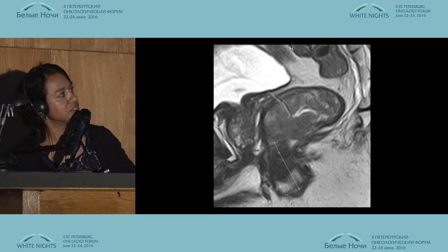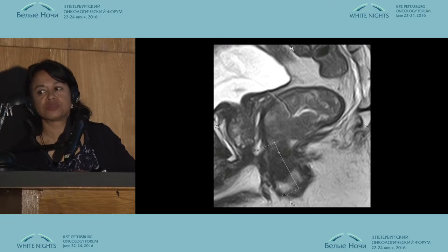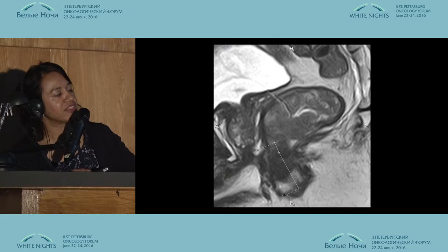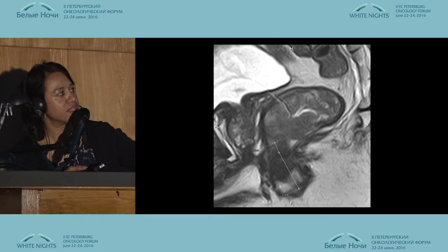These are the measurements we took. We always measure from the lowest point of the internal sphincter, which you see here, and that clinically correlates with the inter-sphincteric groove, because we're not really sure about the dentate line. If you take the internal sphincter and measure to the top of the puborectalis sling, that gives you the height of the anal canal. From the top of the puborectalis sling to the lower edge of the tumour gives you the distance to the top of the sphincter complex — so there's eight millimetres between the lowest edge of the tumour and the sphincter complex.